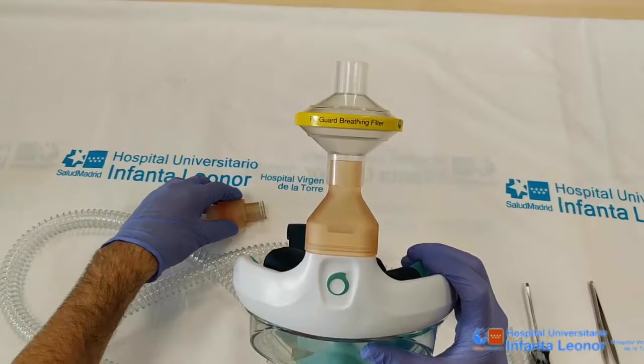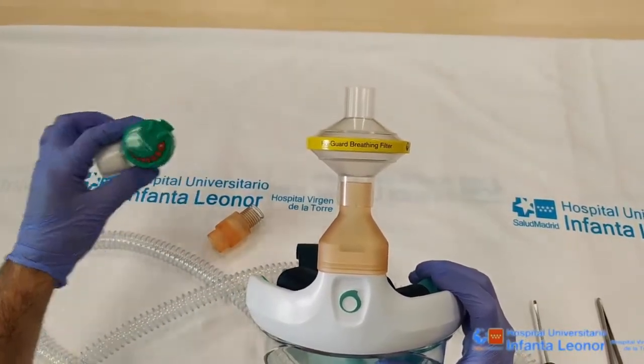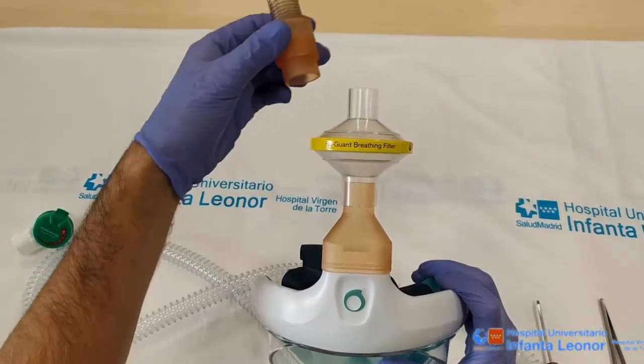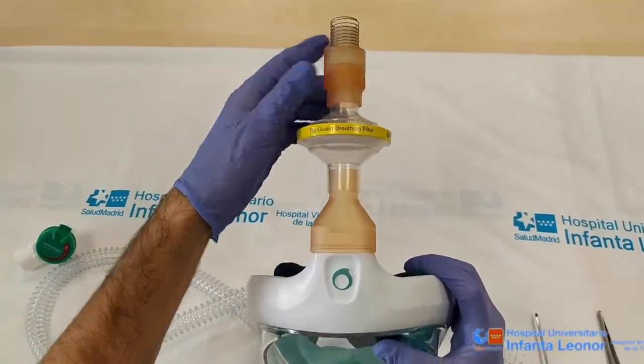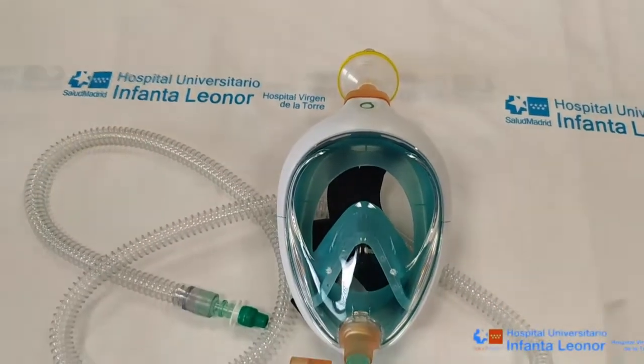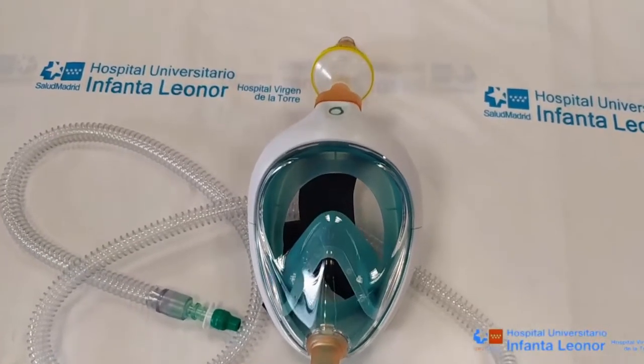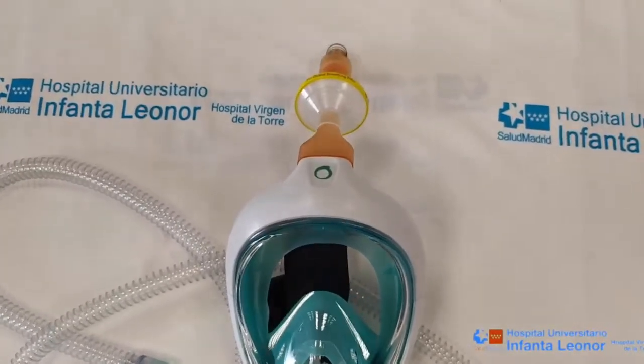Moving on, we connect a high efficiency antiviral filter to the top piece. We can now connect a peep valve or, in its absence, a Maplesone system valve. We fix the peep valve and we now have the completed configuration for this adapted snorkel mask respiratory system with peep valve, designed in the Infanta Leonor Hospital.